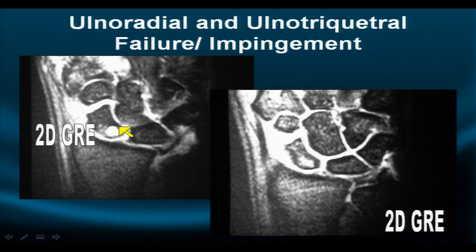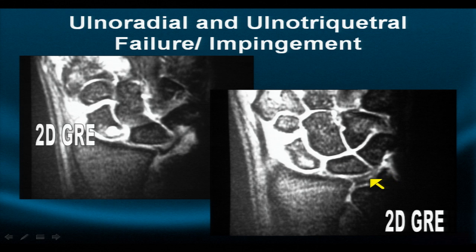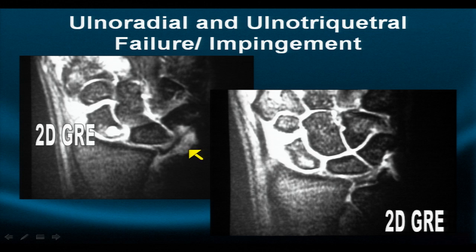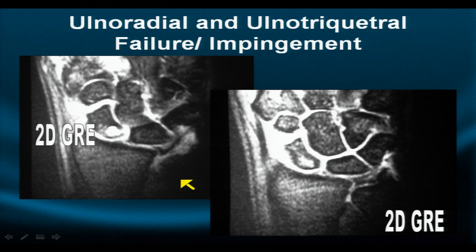The MRI water-weighted sequences show an asymptomatic intraosseous ganglion and asymptomatic synovitis in the scapholunate interval, but demonstrate symptomatic synovitis in the peripheral aspect of the TFCC. The signal inside the TFC is related to degenerative CPPD. The patient's treatment consisted of nothing more than synovial debridement and steroid injection, and the patient markedly improved — symptoms completely abated for almost 10 years. The stretching of the distal attachments of the TFCC with this negative ulnar variance anomaly are apparent.